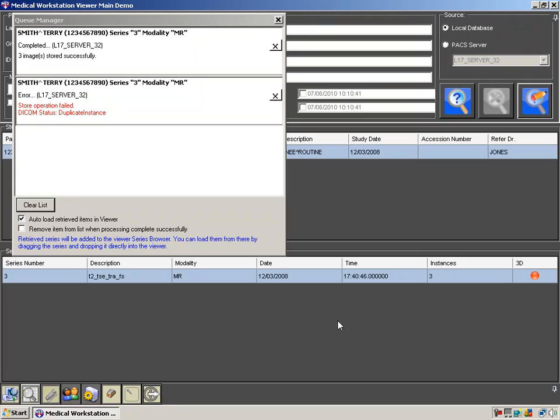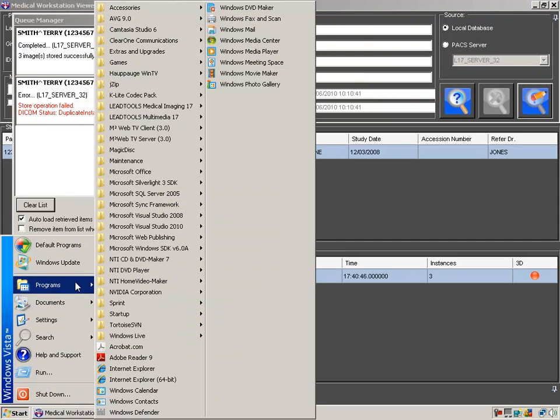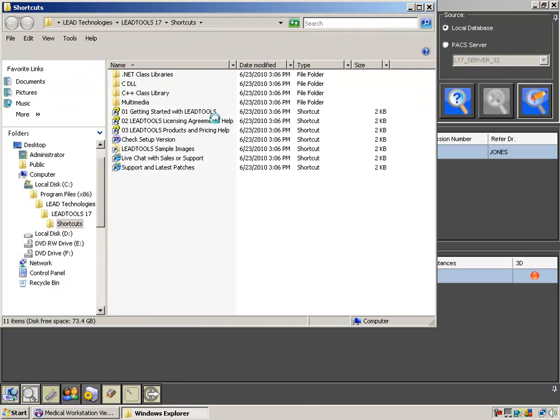To remove the data set we just stored from this remote PACS, we must open the PACS server manager and remove the data set from the PACS's database. Let's browse to the PACS server manager.